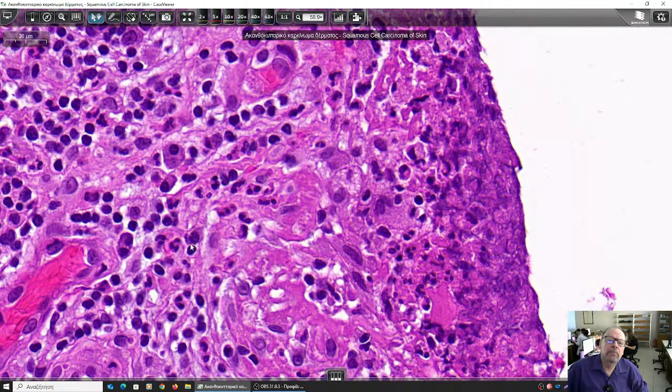Okay, there are some mononuclear cells as well. These are lymphocytes. And there are some lymphocytes which have this morphology. Can you identify them? Do you remember them from the inflammation lessons? Excellent. These are plasmacytes. You can start your sea bathing the next 3 days. It's not necessary to come on Tuesday. Not necessary. You know the plasmacytes.